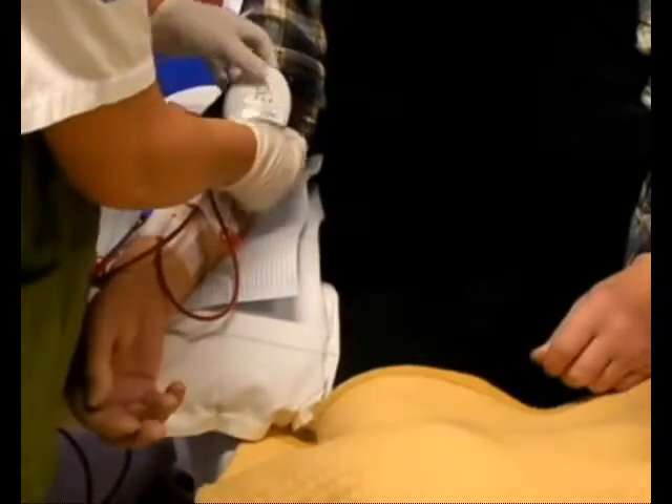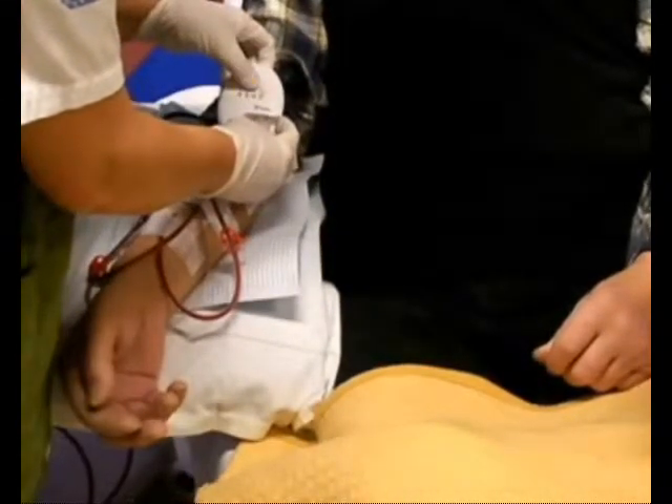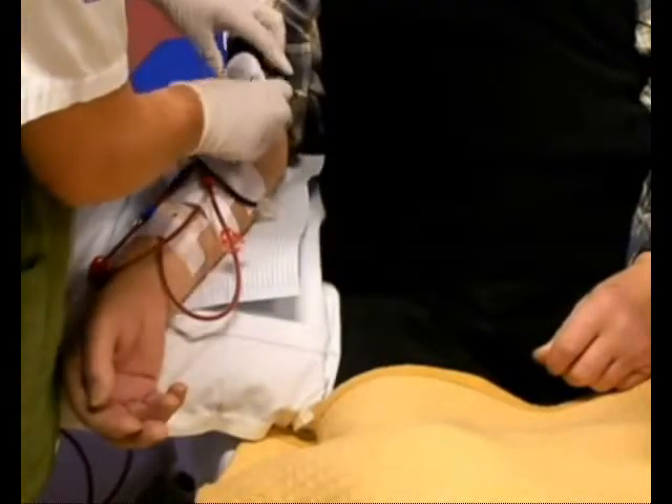After dialysis is complete, hold the button and press down for one second in order to switch off the alarm. Disconnect the sensor patch from the alarm unit. Remove the alarm unit from the patient.